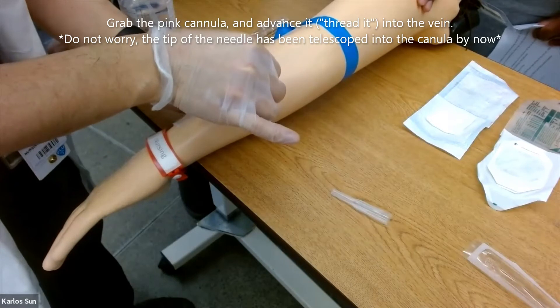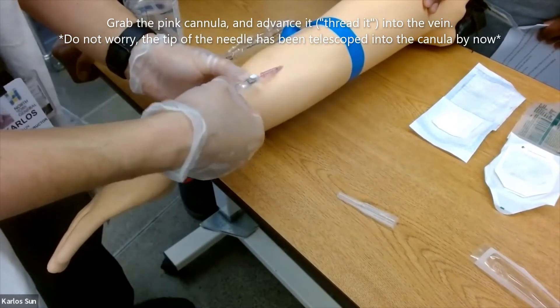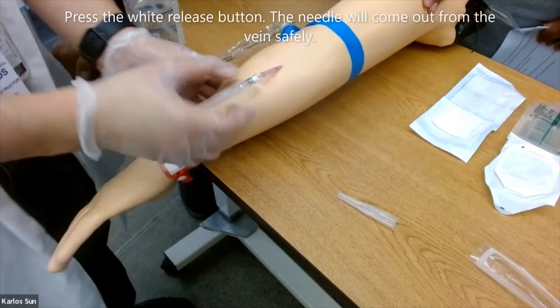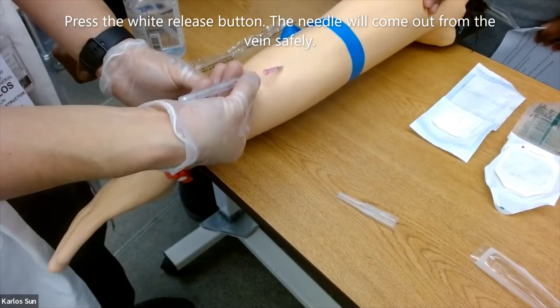Grab the pink cannula and advance it — thread it into the vein. Press the white release button and the needle will come out from the vein safely.